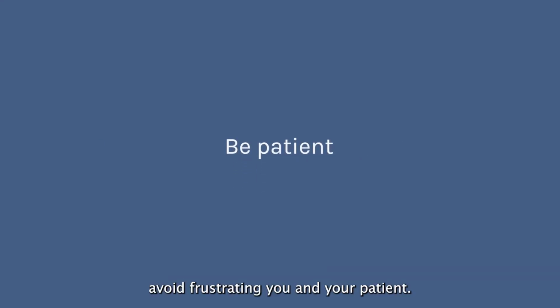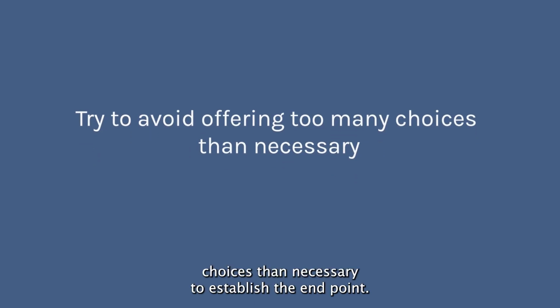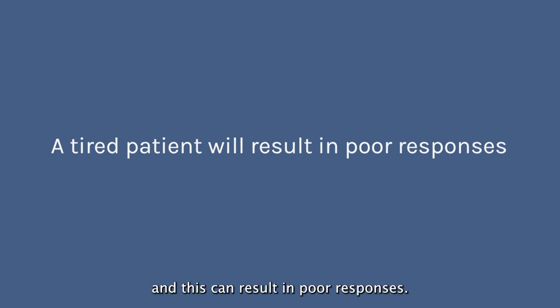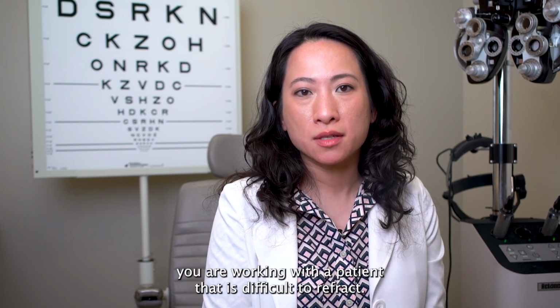Be patient to avoid frustrating you and your patient. Try not to offer more choices than necessary to establish the endpoint. Patients will get tired, and this can result in poor responses. Encouragement goes a long way, especially when you are working with a patient that is difficult to refract.